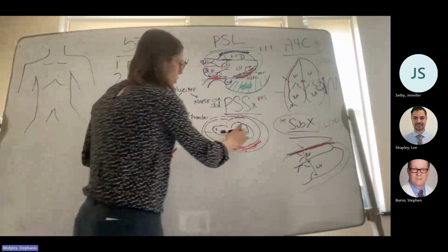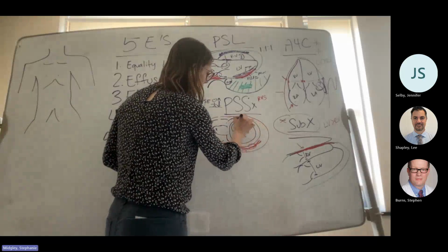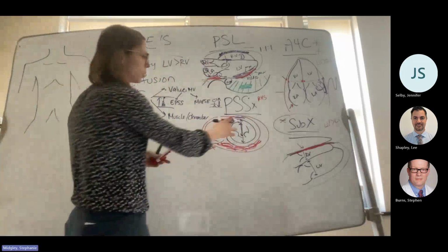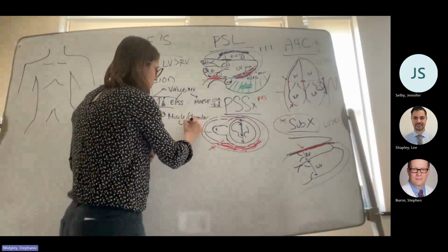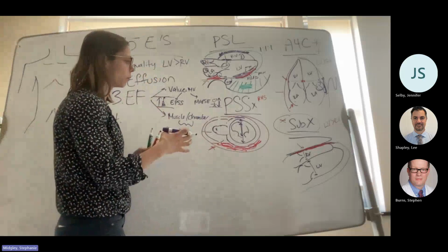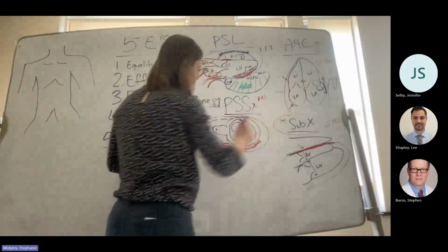The other thing I look at is the chamber. So how much does my chamber size change between systole, right, and diastole? A normal EF is about a 40% chamber size change. So when it comes to this one, my parasternal short is really my favorite view because it's just pure muscle and pure chamber. This one's pretty good, so you can use your parasternal long. And then my apical 4 is also really good.